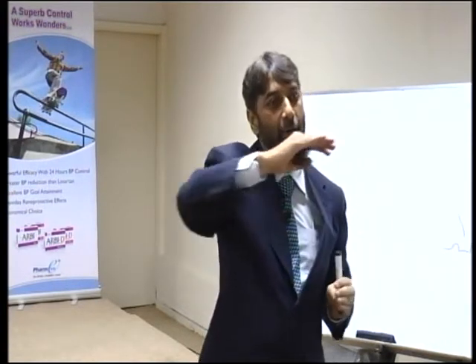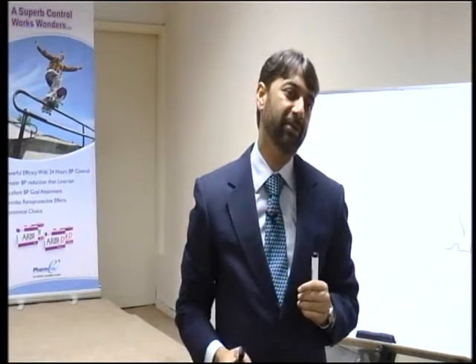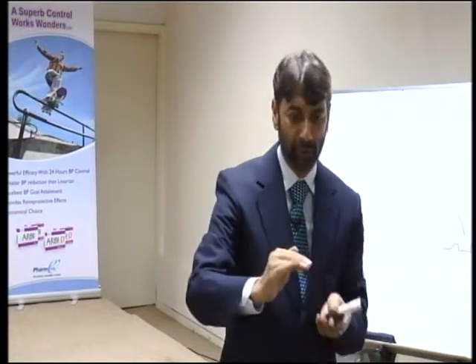And how to judge then after assessing this J point? You have to compare it with the TP segment. Compare it with the preceding TP segment, whether the J is up or down. And for this I keep saying, you need an ECG recording in a straight line. If the complexes are going up and down like this, this assessment will not be possible. And you only have to look at that J point.